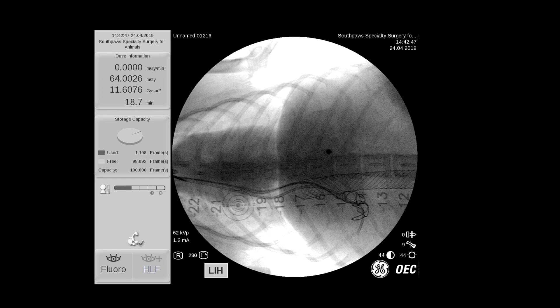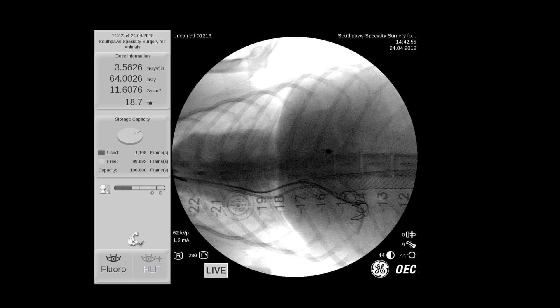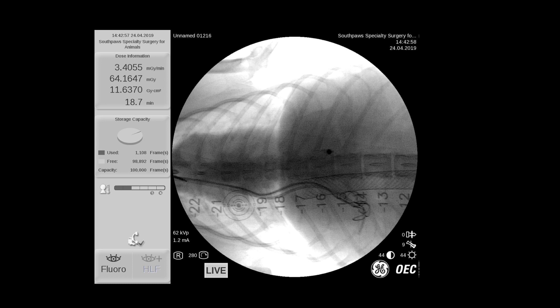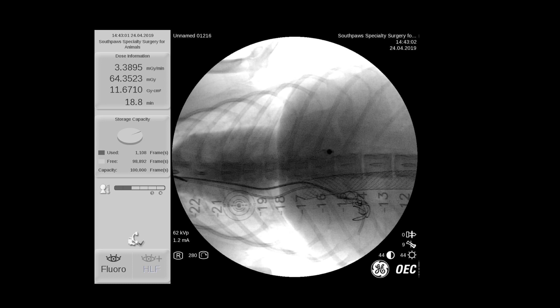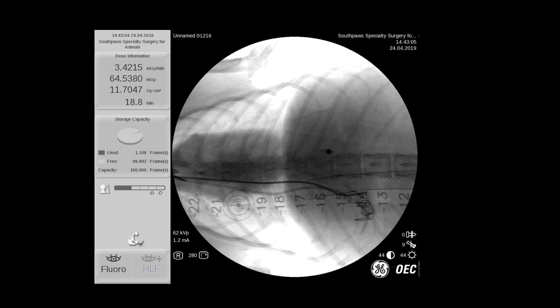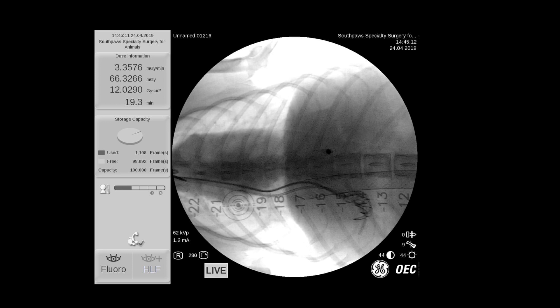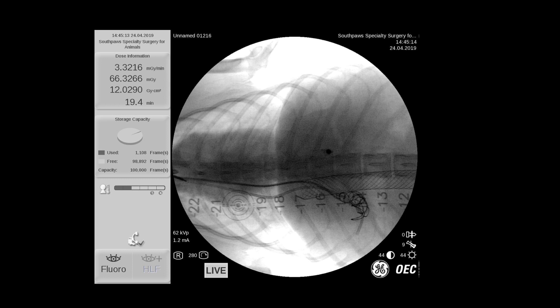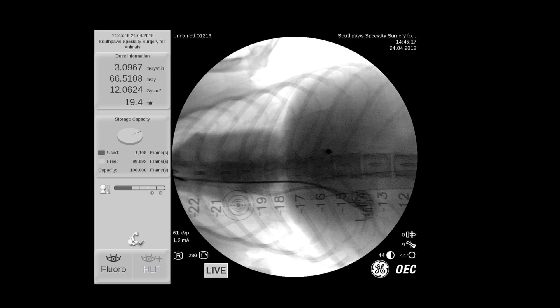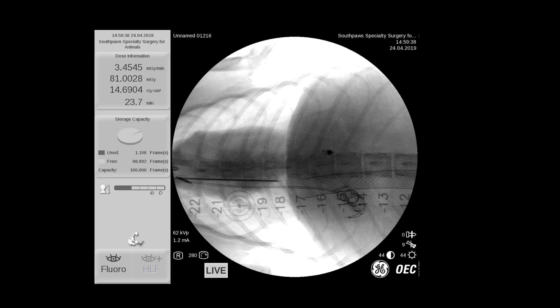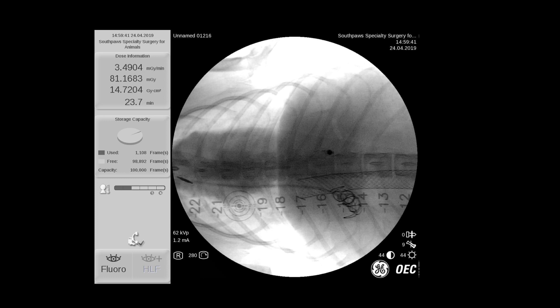We're targeting approximately eight millimeters of mercury differential between the portosystemic shunt or the portal vein and the vena cava. We continually place coils in the shunt until we get the adequate gradient between the two vessels. Once we're satisfied that we've achieved enough of a gradient, we can then remove all of the catheters from within the liver.